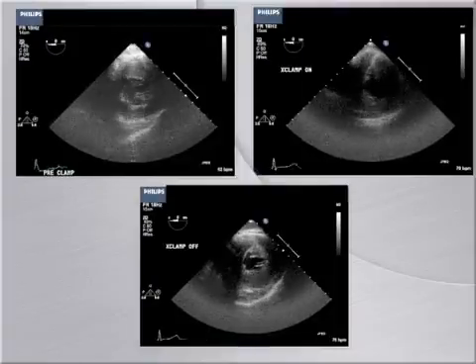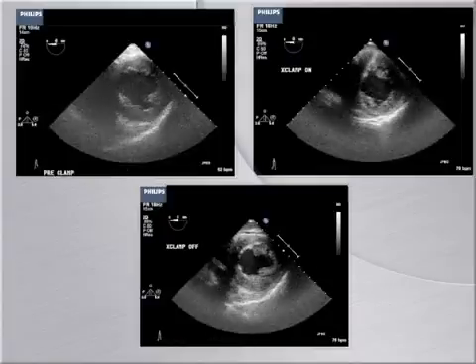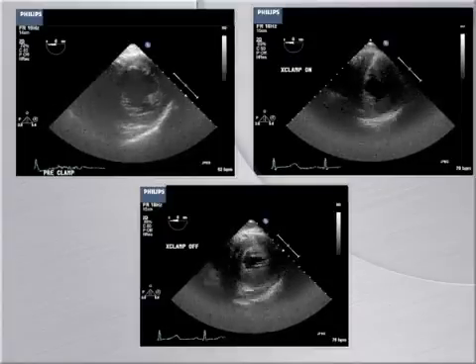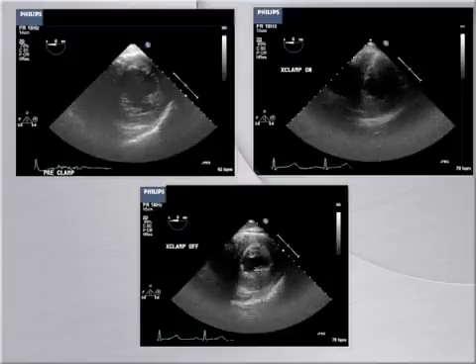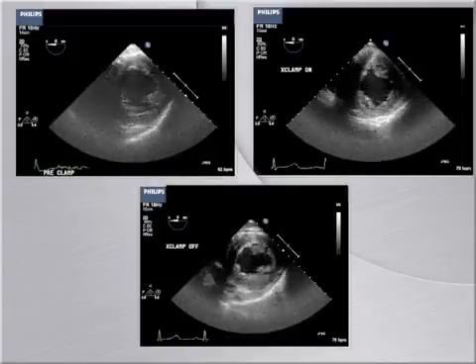This series of images depicts the impact of sudden increases in afterload on the myocardium during application of a cross clamp for aortic surgery. On the top left, we see a normally functioning myocardium with a normal ejection fraction greater than 55% and normal wall motion.